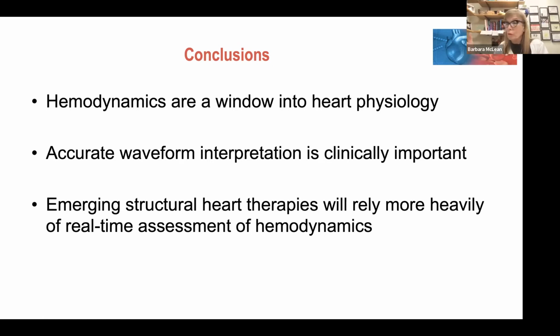No matter where we work, we're looking at CVP pressures. And if we're not, we should be. And we should be looking at CVP waveforms. But remember, you can only evaluate the waveform in a 2-channel recording with EKG and CVP. Same will be true for wedge pressure.